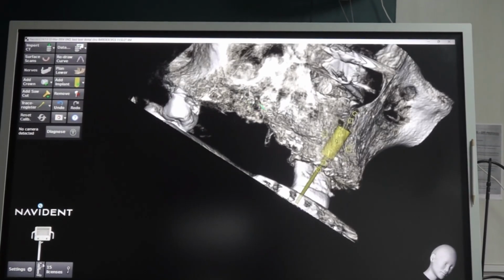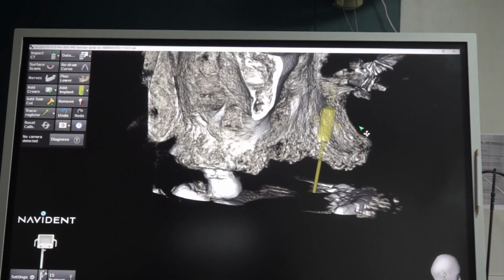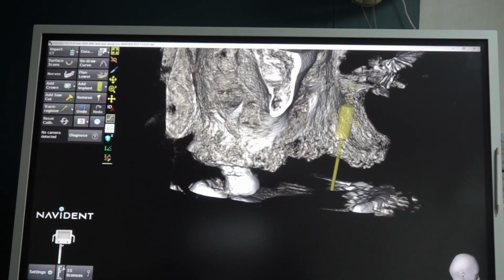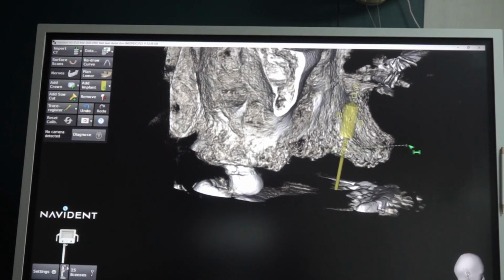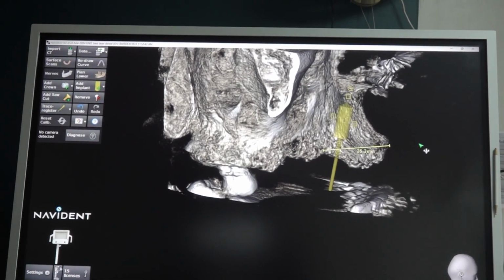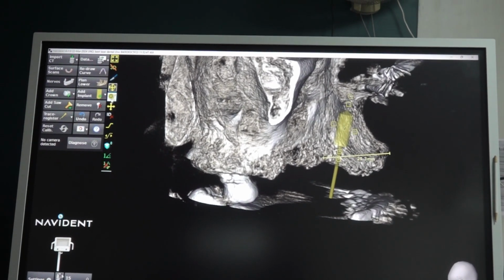So not only height, but also the labial. Labially also we have to shave. Imagine you are cutting it like this, vertically. Right? Will it solve the problem? No. There is a prominence here, so we have to cut it here also.